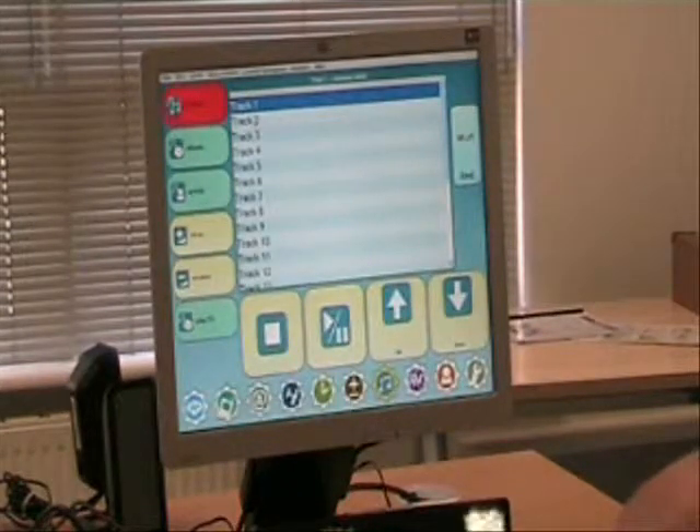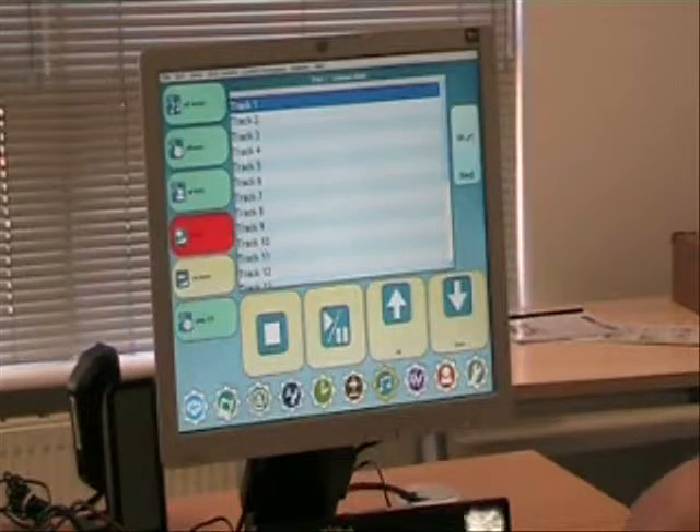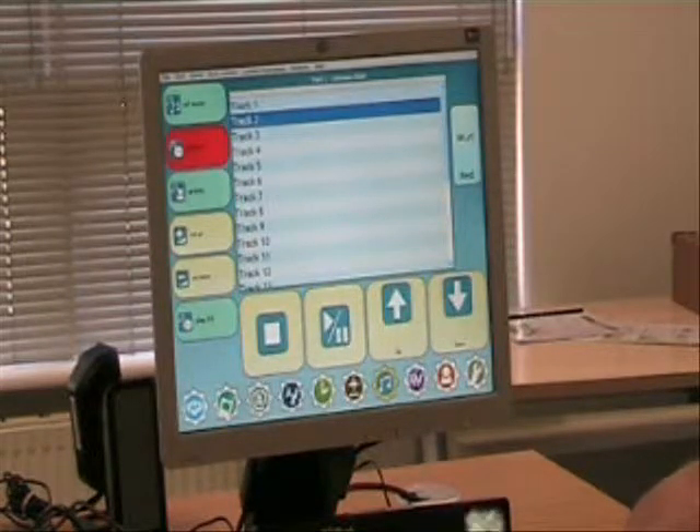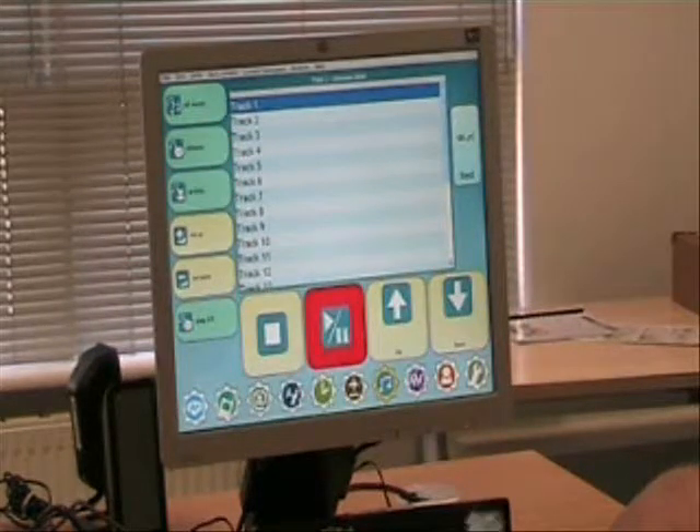Now I want you to play that first track up there. I've already loaded the CD in the drive of the computer, so I want you to pick a track and then press the play button down there. Excellent.